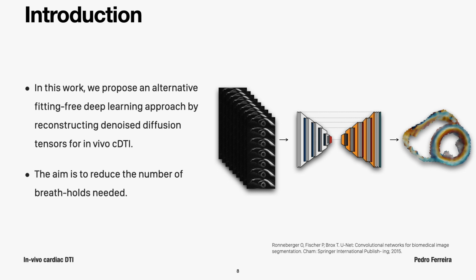We replace the tensor fit with the U-Net. U-Net CNN architectures have been commonly used in biomedical image segmentation problems and adapted here for image generation, in particular the tensor components generation.